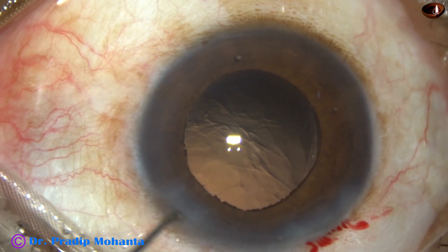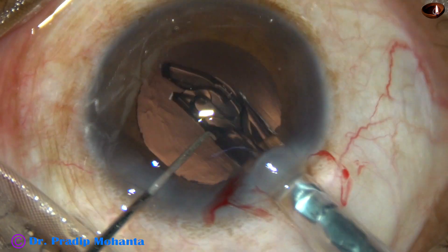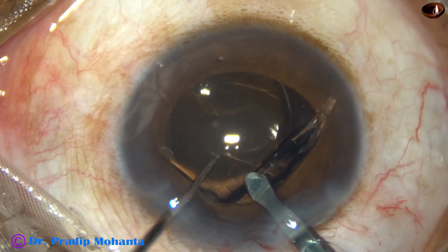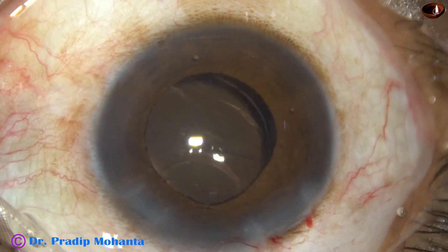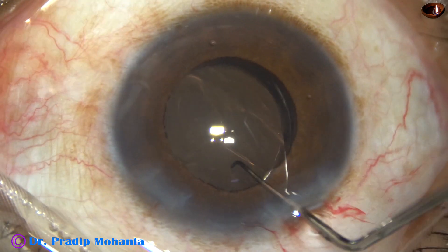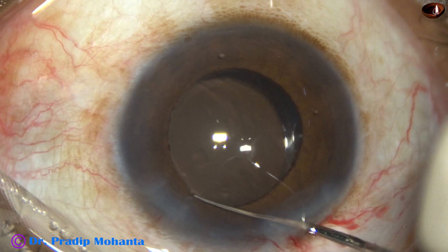And now this is the intraocular lens — a hydrophilic acrylic single-piece monofocal intraocular lens, and it is going into the capsular bag. The lens has gone into the capsular bag. Now I am going to spend some time for removal of the viscoelastic substance that has been used — 2% hydroxypropyl methyl cellulose.